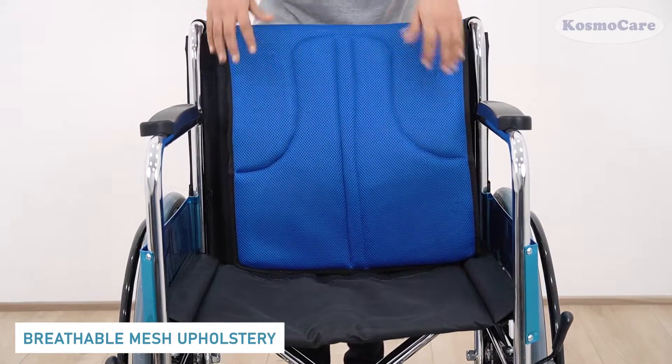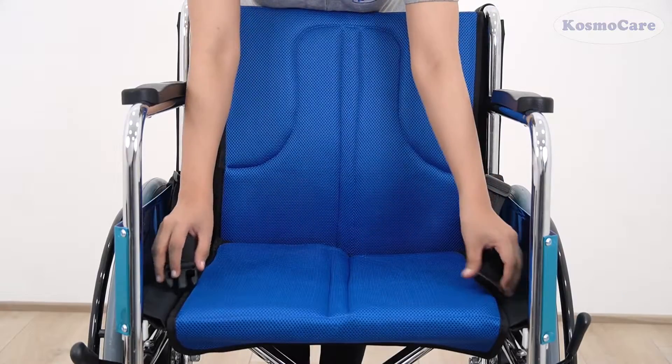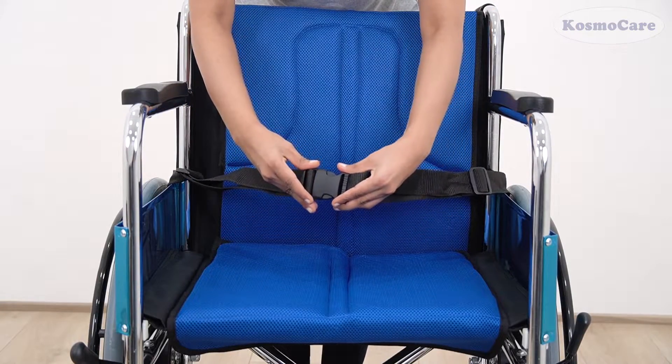The seat is upholstered in a comfortable mesh fabric that is water resistant and also breathable, and the built-in seat belt enhances user safety.